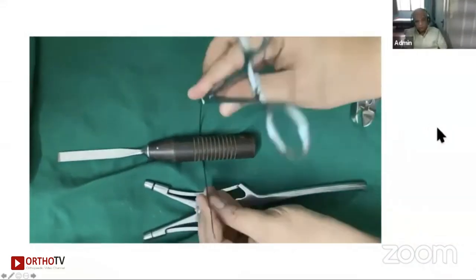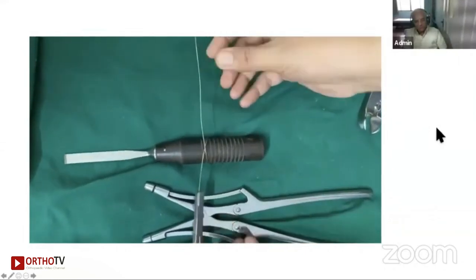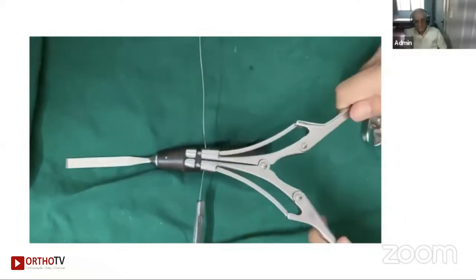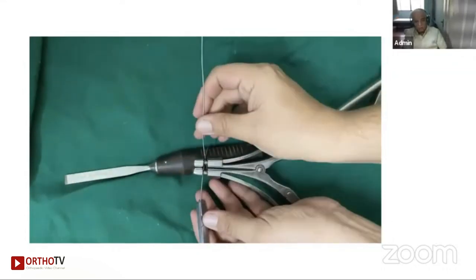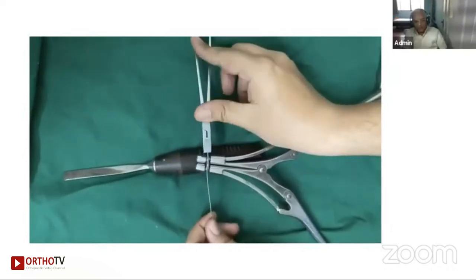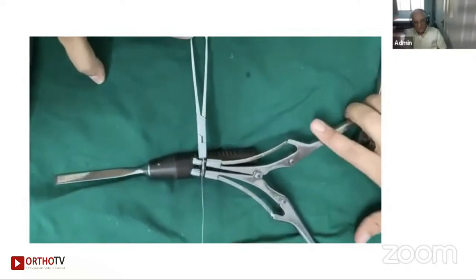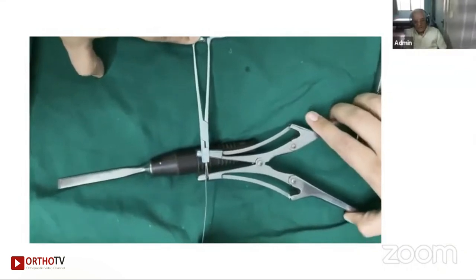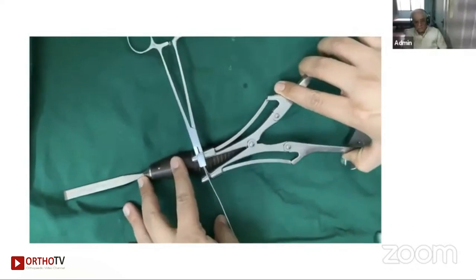This is how it is used. You take the two ends, cross them and put them into the slot and hold them. Only one end has to bite. You can't bite both of them into one. Only one is biting. And once it is biting, you will get a perfect tension, so there is no slack which remains anywhere. You get a perfect tension, and with the same thing, you twist them.